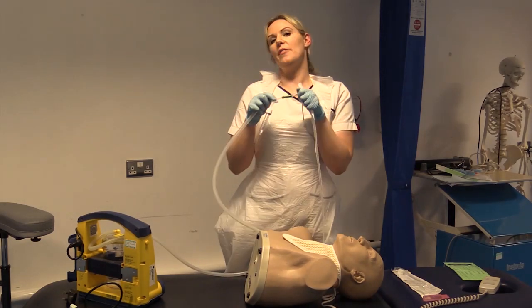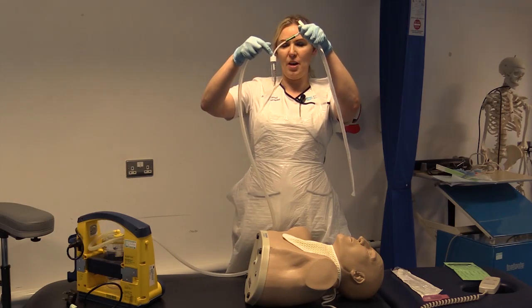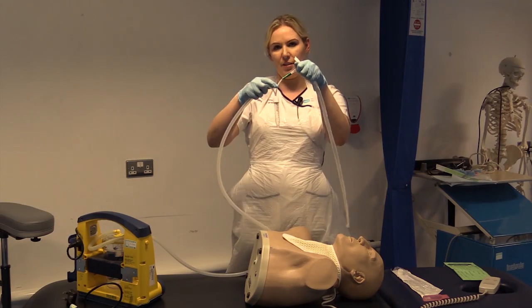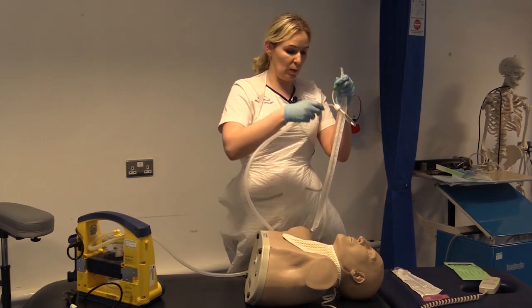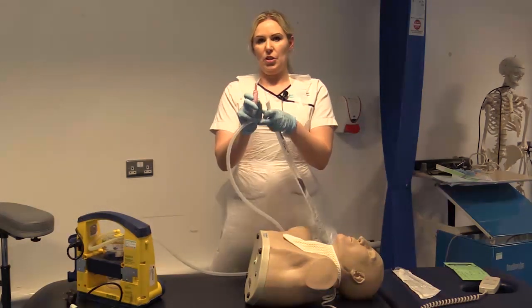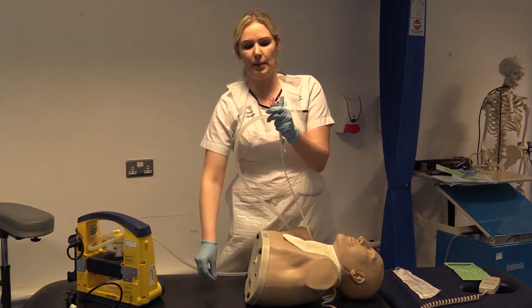Okay, so if after your suction's complete there are no secretions in your sputum trap, what you're going to need to do is, if there's secretions in the tubing or in the catheter, you're going to want to mobilise that with some sodium chloride. Okay, so what you do, you just open the top of your plastic vial.